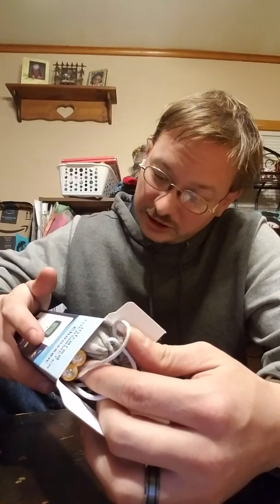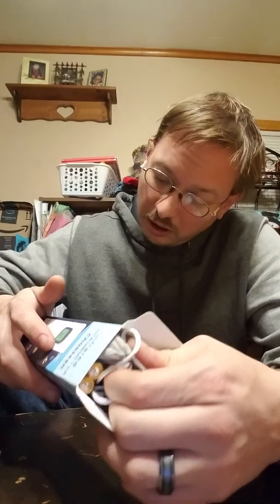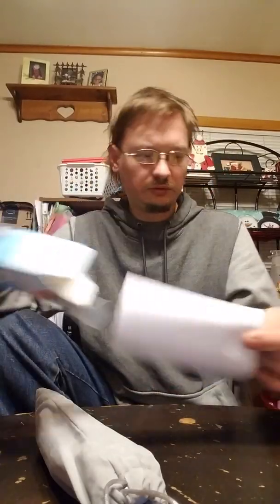It does come with batteries — it takes two AAA. There's stuff in there — batteries! And it does come with an instruction booklet.